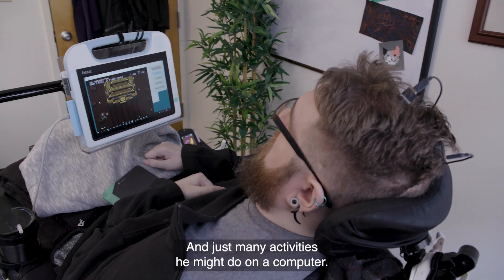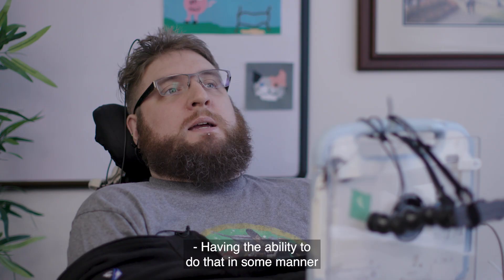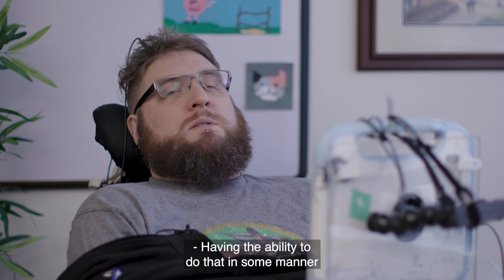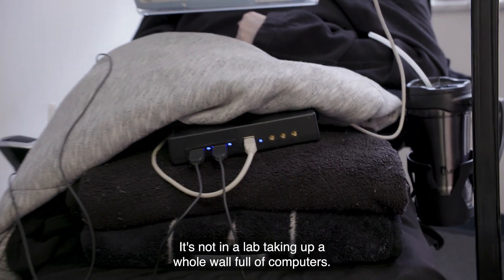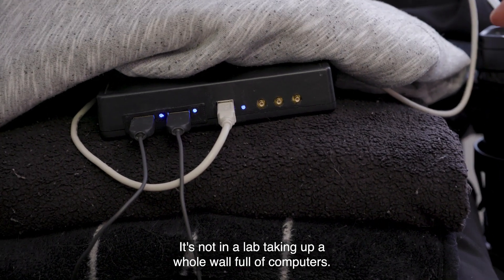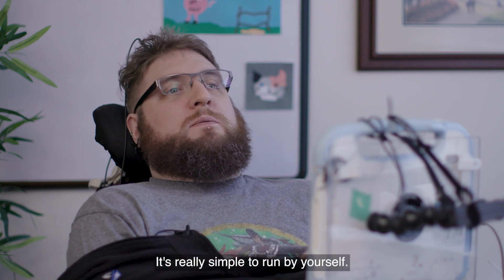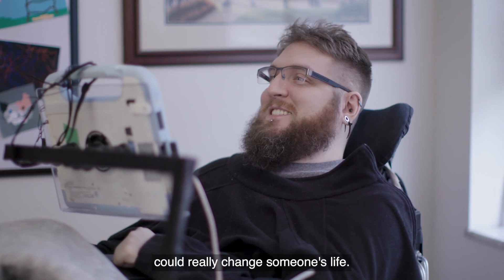Having the ability to do that in a portable way — not in a lab taking up a whole wall full of computers — and it's really simple to run by yourself. I think that kind of thing could really change someone's life.